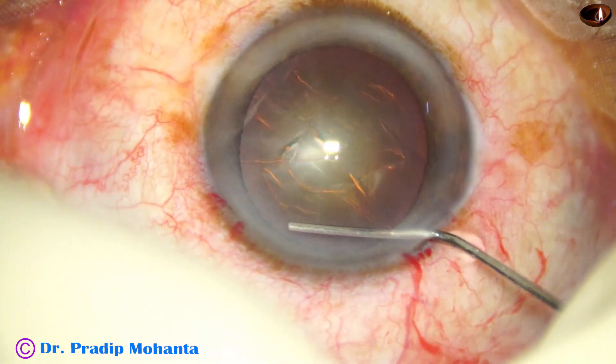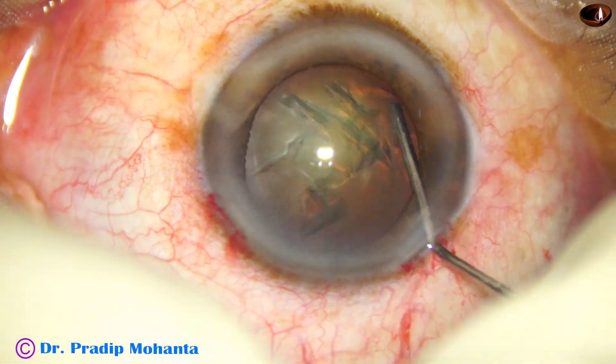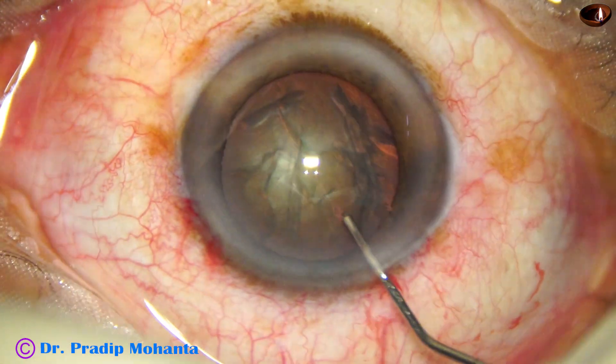Now hydrodissection is done with BSS and a 27-gauge cannula. The nucleus is mobilized.